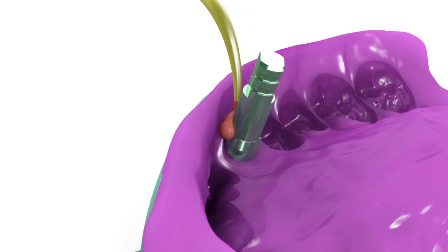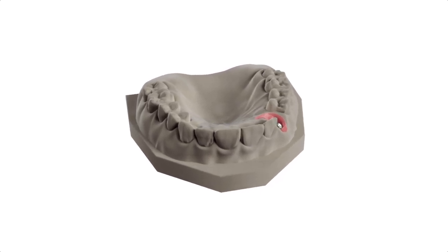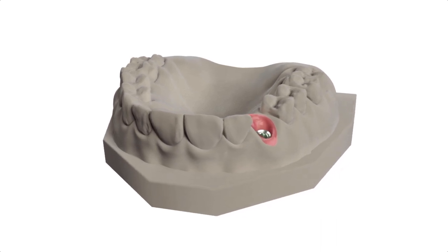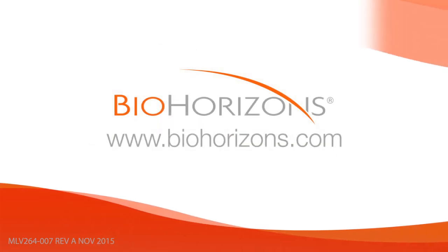Syringe soft tissue replica material around the analog. Fabricate a working model using minimal expansion high hardness dye stone. Articulate the model according to normal laboratory procedures.